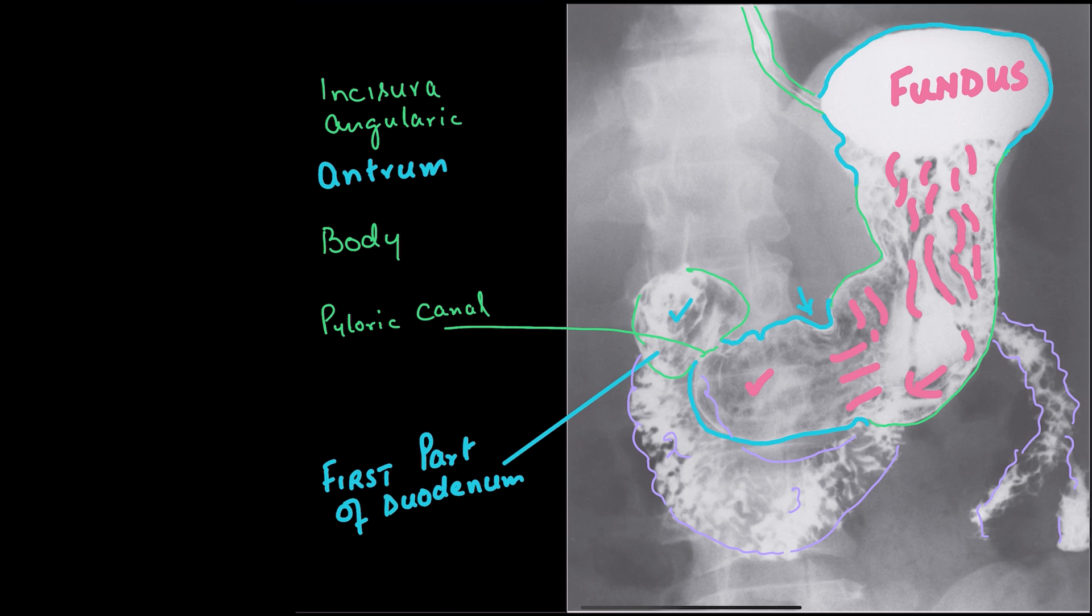Let's recap. You are looking at the esophagus. Then you can see the fundus part of the stomach. This part is the body of the stomach. Then we can see this portion, we call it the antrum.